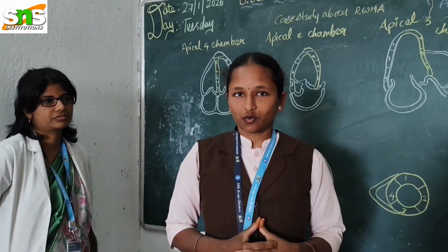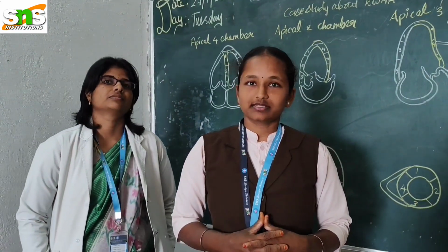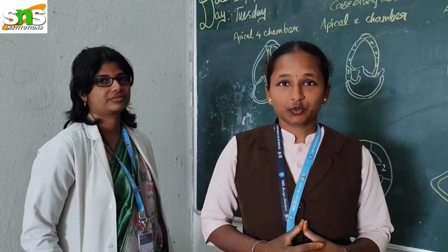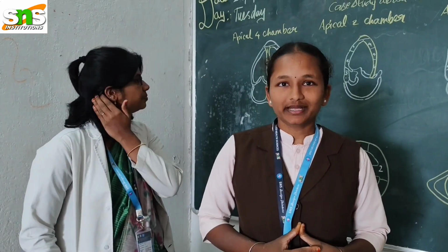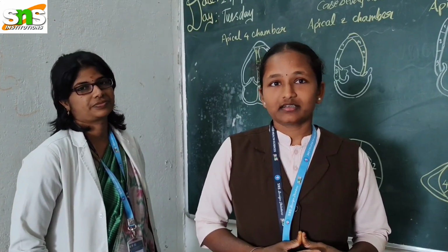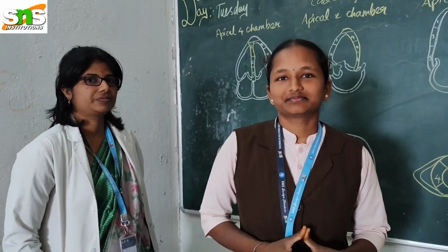Echocardiography plays a crucial role in ischemic heart disease because it allows non-invasive bedside evaluation of myocardial structure and function, helping not only in diagnosis but also in risk stratification and detection of complications.